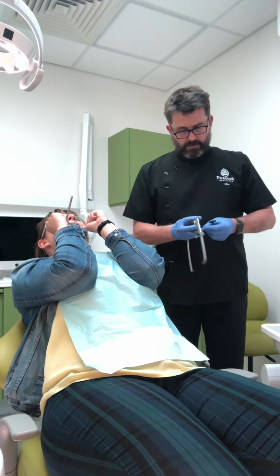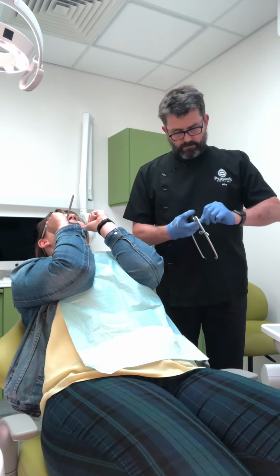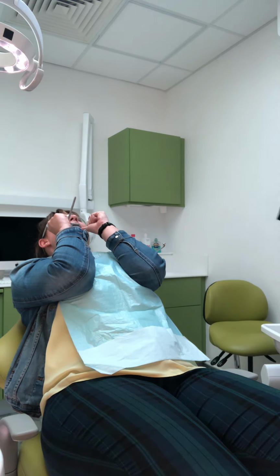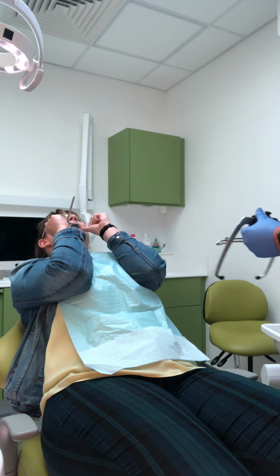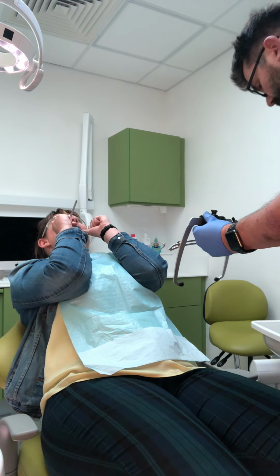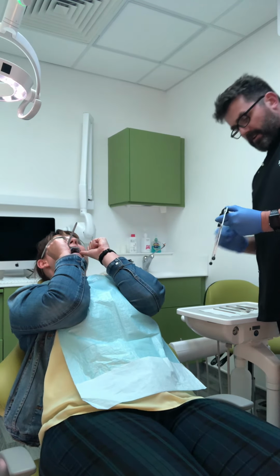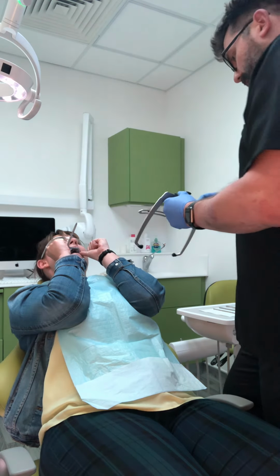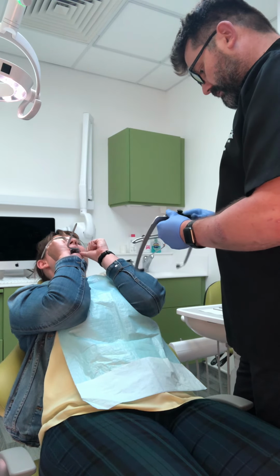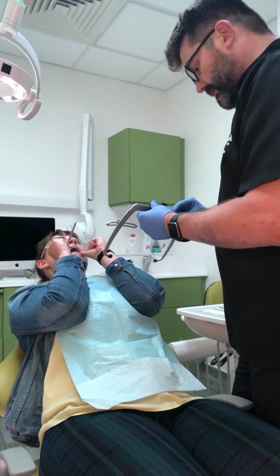So we go to the Facebow, and to attach the jig. Come on. And then with the Facebow jig towards me, there are two universal joints on that. One of them has a 1 on, one of them has a 2, and that's how you adjust them. So if there's any medical students watching, the 1 goes first, it's a bit of an up and downy one, and the 2's a bit wiggly, and that goes second. So I'm going to loosen off the lock so it'll slide. Just check everything slides nice and easily, and this reference point has a bit of resistance to it.